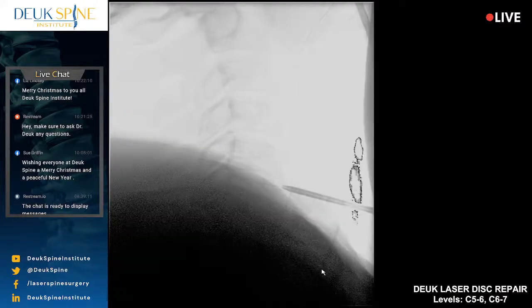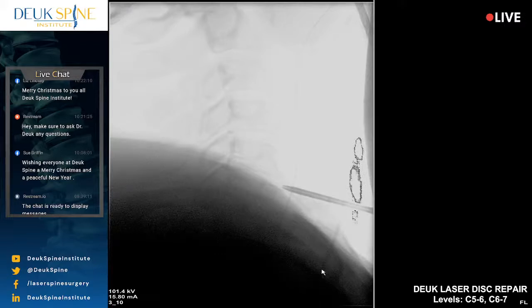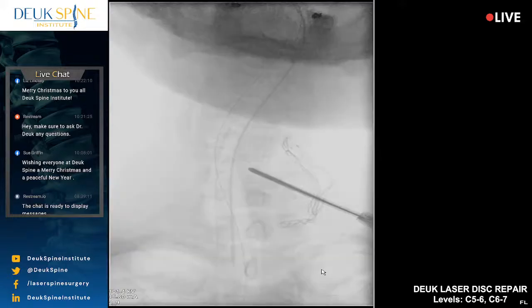Shot. I'm definitely on the disc. Let's see if I'm in the middle of the disc. Shot and AP. Let's see where we are. Quick AP. He's still relaxed, right? Good. Quick AP. So I've moved from, there's 2, 3, 4, 5, 6. A little bit off to his side. I want to bring it back to mine. By his side, I mean Luis's side.